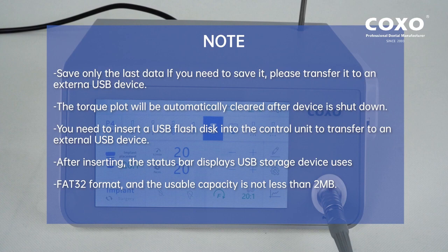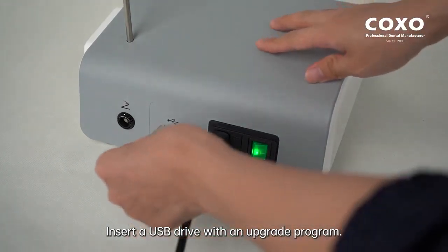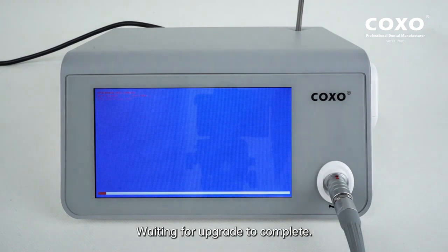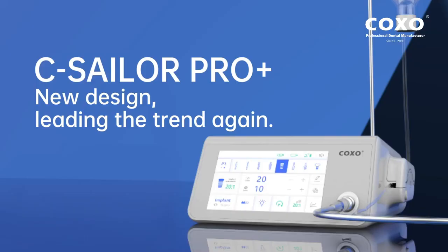The USB drive uses FAT32 format and the usable capacity must not be less than 2MB. Insert a USB drive with an upgrade program and wait for the upgrade to complete. Unplug the USB drive after the upgrade is completed.